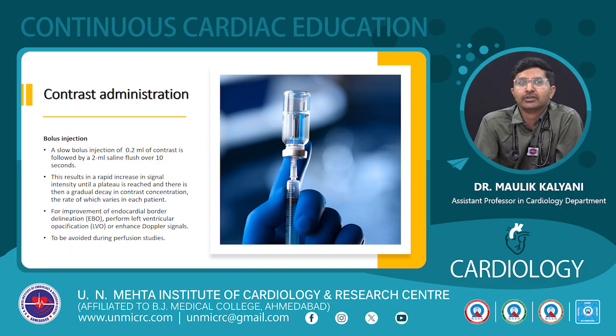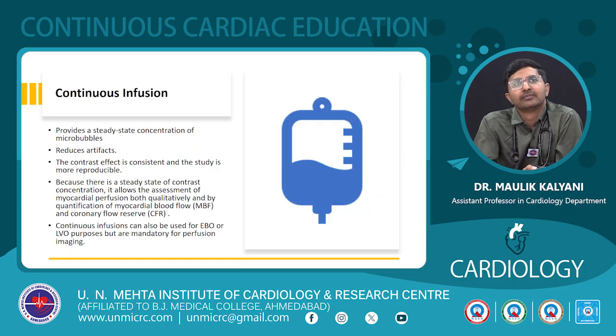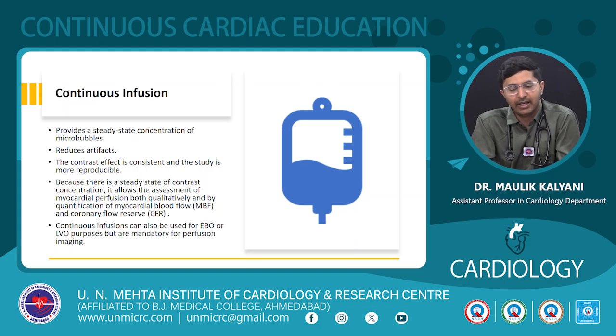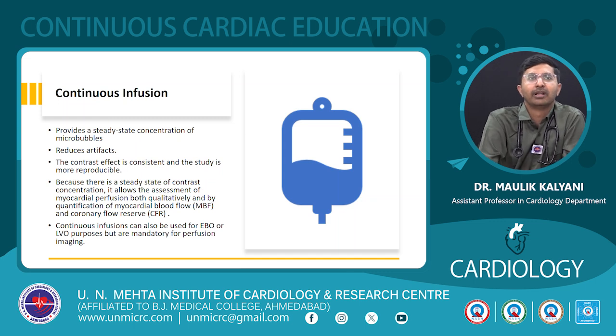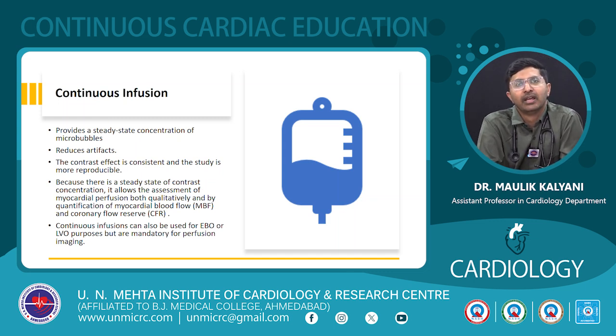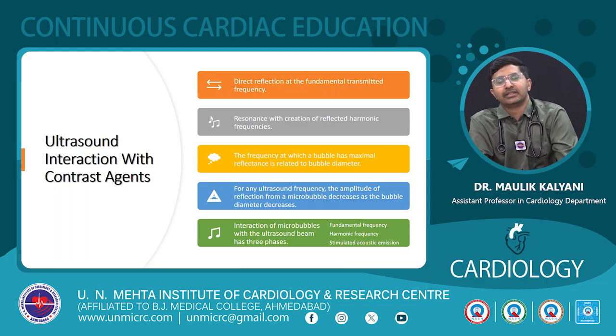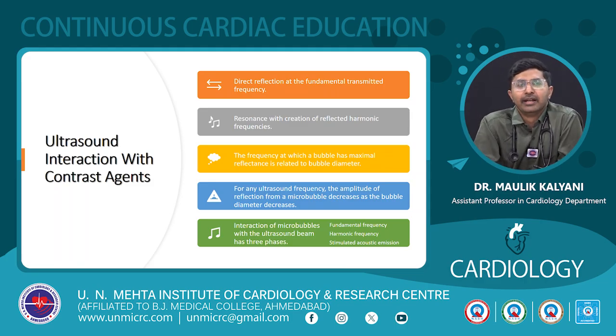And as we have used right-sided contrast, we can also use Doppler signal enhancement with left-sided contrast. A continuous infusion gives you a steady-state concentration of microbubbles and also decreases artifacts. Because it is consistent and the plateau is maintained, it helps in studies like perfusion imaging, myocardial blood flow, and coronary flow reserve calculation. It can also be used for endocardial border delineation or LV opacification, but for that you can also use a bolus.